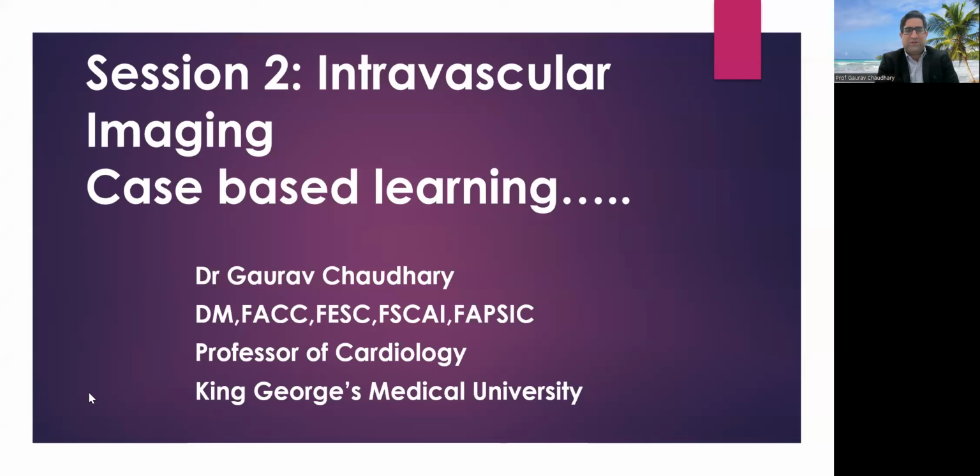So welcome all, coming on to session 2 of the Intravascular Imaging Academy. In this, after having a brief discussion about how to interpret the image of OCT and about the basics of the OCT technique, I would like to discuss in this session how we can assess what the image is showing. So this would be a case-based session.